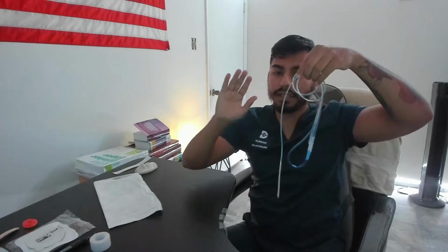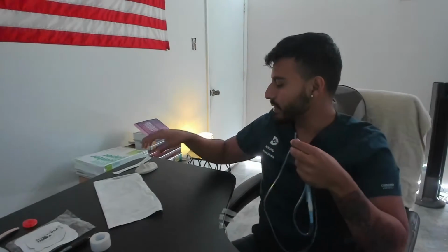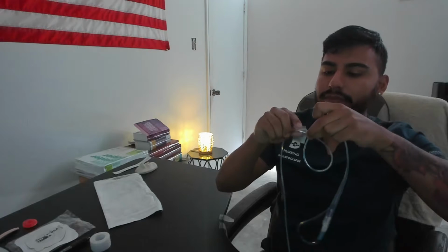I'm going to be careful not to contact it to the floor, the bed, anything as much as possible. So what I'm going to do is measure, using myself. The tip of the nose to the tip of the tube, go straight to the earlobe and then go straight to the xiphoid process. So we're going to go right here. I'm going to mark my tape to where my index finger is. I'm going to tape the tape to each other, and that is where my marking will be, right here.